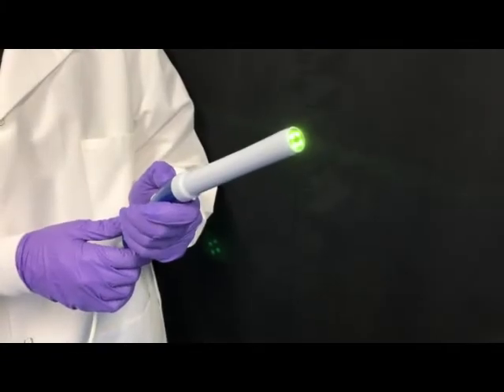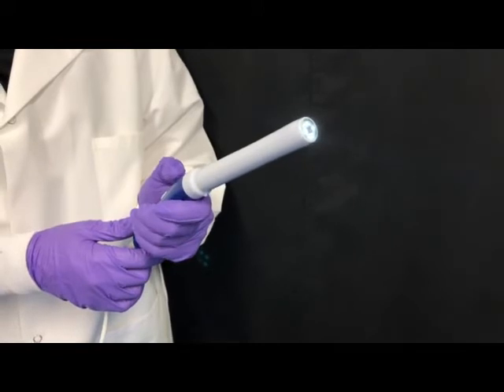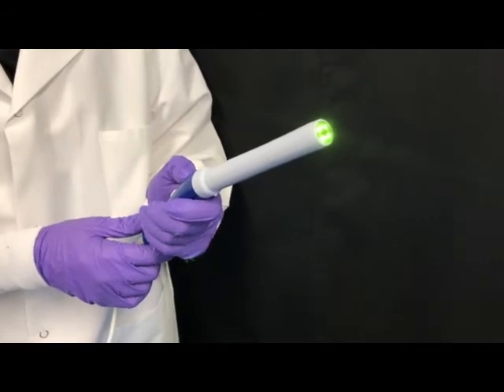If both the green and the white lights are on at the same time, press the light toggle button until the lights turn off and then return the lights to the desired setting. If the problem persists, call Hadley Health Technologies.